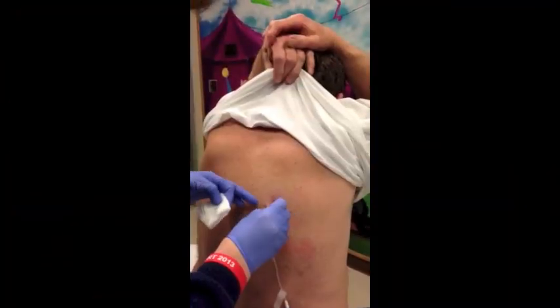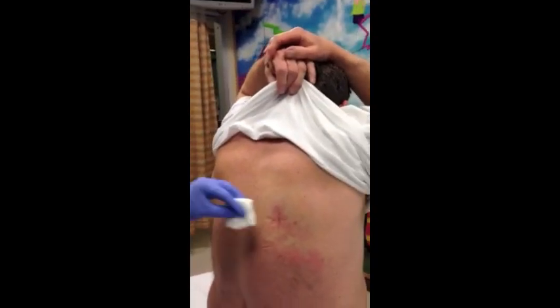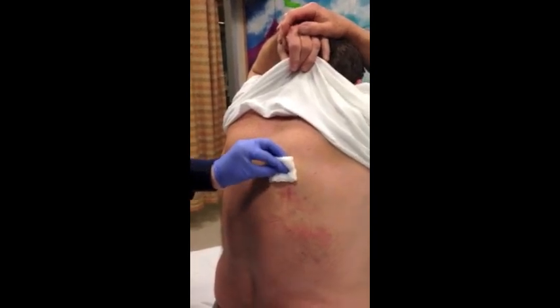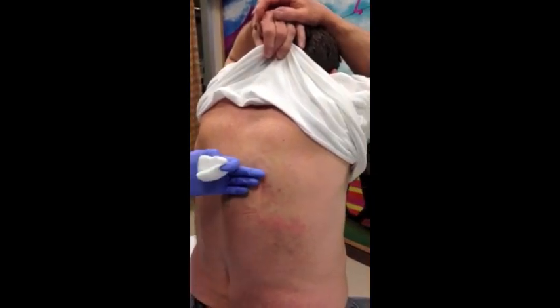That would probably bother the kids more than anything. I wonder if you could put a gauze bandage with paper tape or something over it. Look at that — it doesn't even leak. There's no leakage from the site. It's not swollen, it's not hard, it's even warm. Is it itchy? No, it doesn't feel anything.